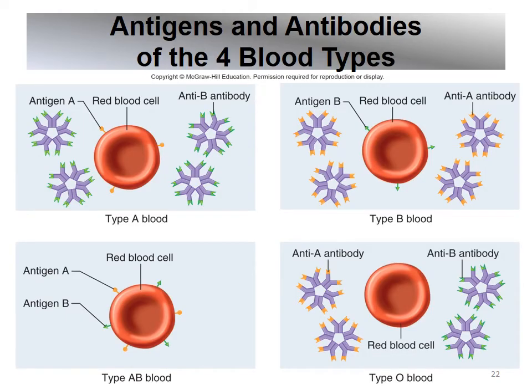Remember, we get all these things kind of complicated. There's only three possible antigens and only three possible antibodies. Remember to call the antibodies anti-whatever, and it just makes sense how they mix and match.